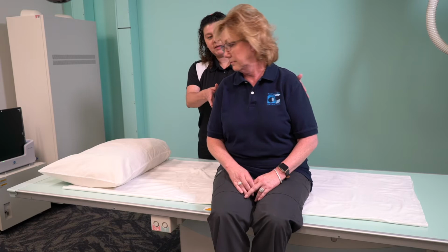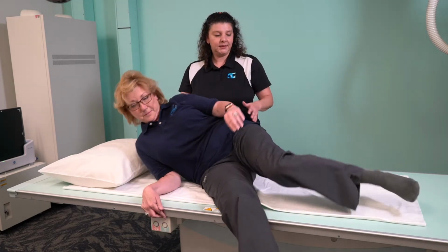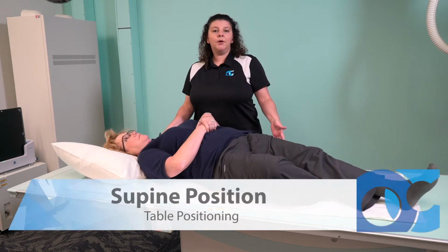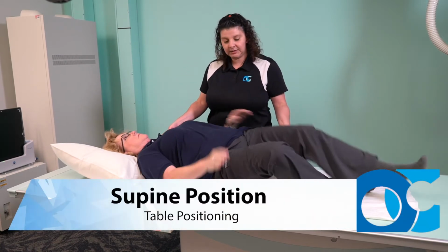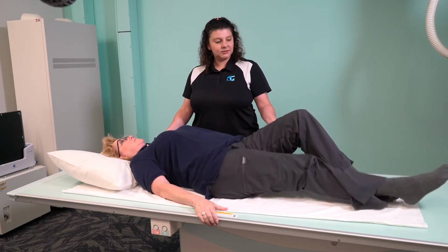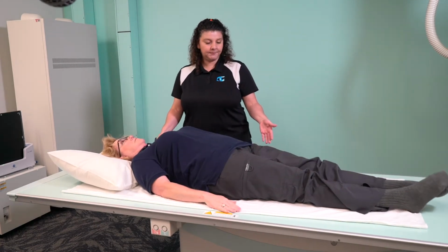So we're just going to get my patient here to lay recumbent. She's just laying in any general position. Now I want her to be in a supine position, so I need her to lay flat on her back. Good. So that is our supine position here.